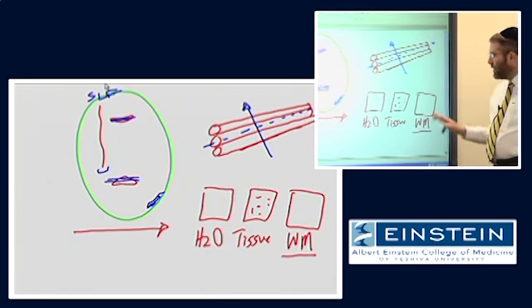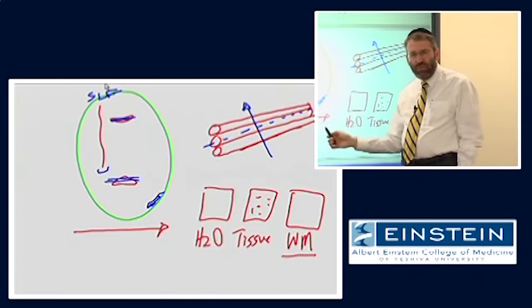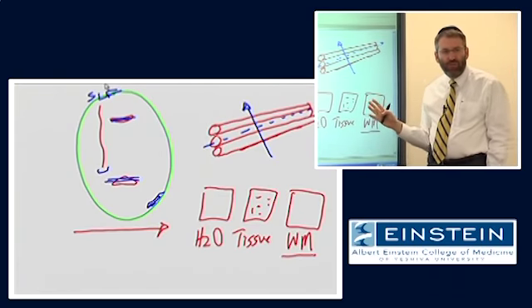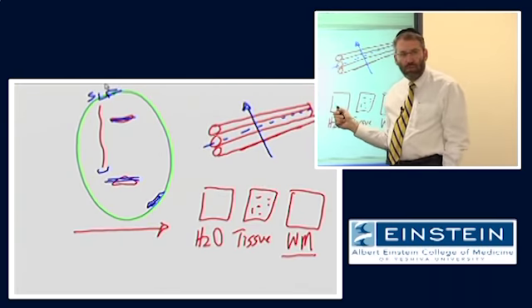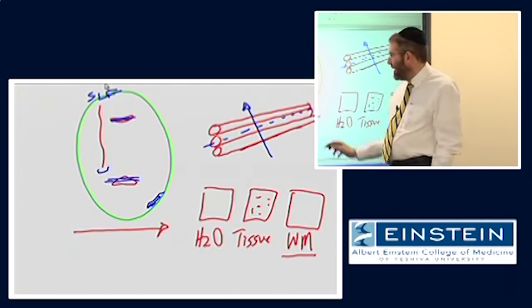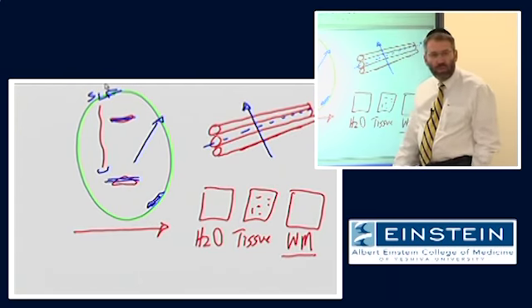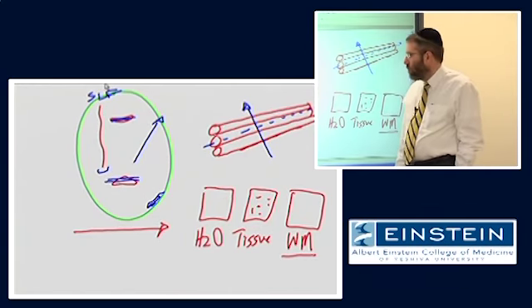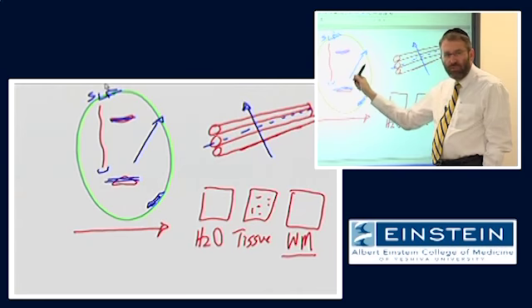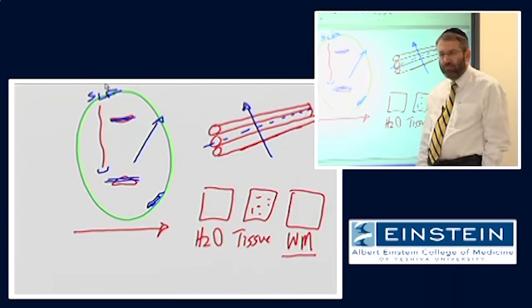So looking specifically at white matter, if we sensitize to diffusion in a single linear direction, we are going to differentially affect the signal based on the orientation of the white matter fibers. And if, for example, there would be some obliquely oriented fiber bundle, we will detect an attenuation proportional to the amount of diffusion, the vector of diffusion that's parallel to that fiber. Okay?